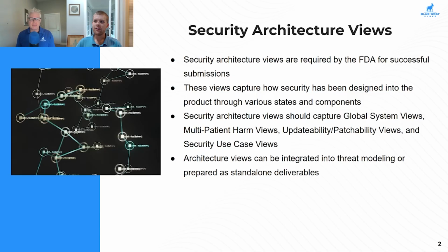I would. Having security integrated into your architecture views is an artifact of secure coding practices. It's an artifact of developers taking security seriously and ensuring that they're covering all of their bases on these difficult topics. So if you have an architecture view where you take a look and you're not sure how security is mapped to any of these components, you're not sure where there's risk in your device based off of these architecture views, that's a little bit of a difficult situation compared to having a clear, concise understanding of exactly what needs to go into play there.